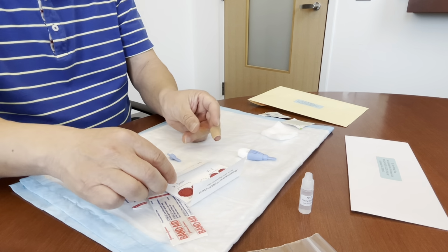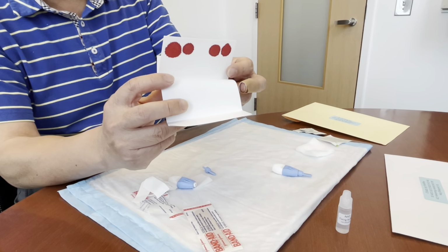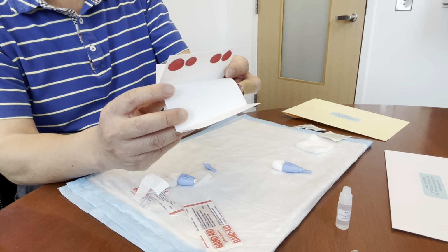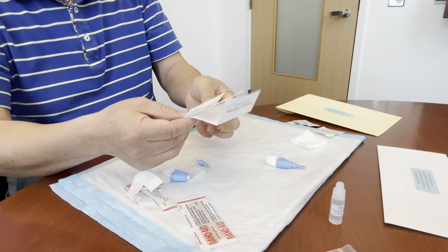To ensure we have an adequate sample for testing, please make sure the blood spots have soaked through the filter paper card so that you can see it from both sides. We have included an extra lancet in your kit if you need to do a second finger stick to get a large enough sample.